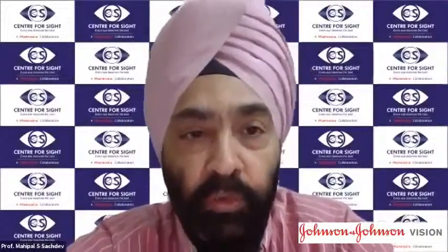You can have it pupil maximized, you can have it centered on the pupil, you can have it centered on the limbus, or you can do it manually. So that is something which gives you the flexibility. I think in subluxated cataracts, etc., femtolaser, Professor Chi also uses that. That gives you that actually you don't have to dream to get a capsulotomy like Professor Chi does, because I think she is one of the best surgeons in the world.